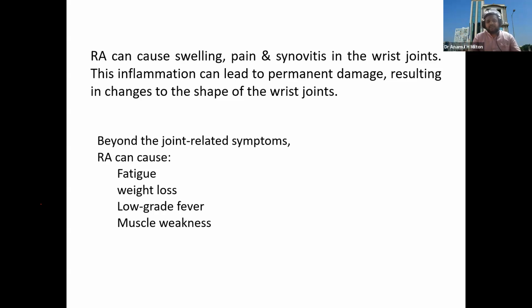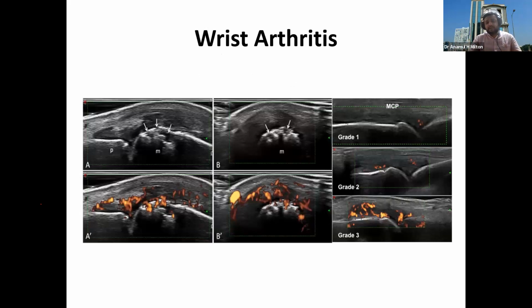Sometimes many of the patients say, I cannot take my shower, because even in the summer when the temperature is so high, I cannot take a shower because there's a low grade fever within my body. So this is the USG part, and you can see a lot of collection and synovial thickening, and the Doppler shows a lot of color within the synovial thickening area.